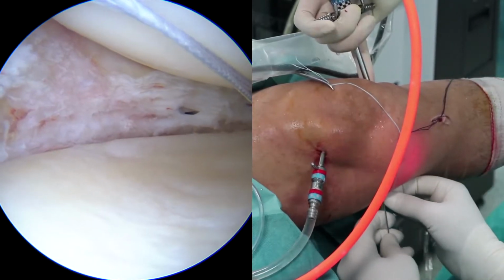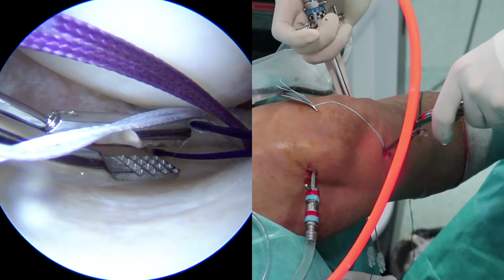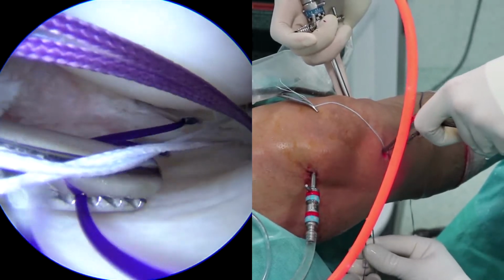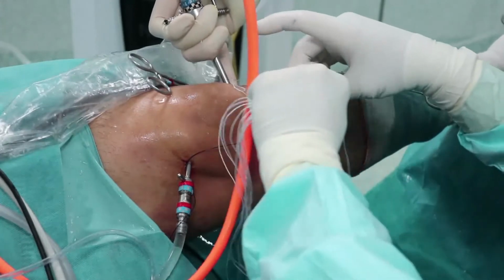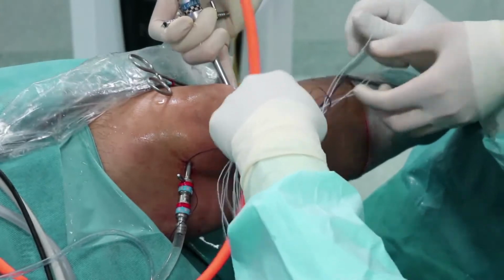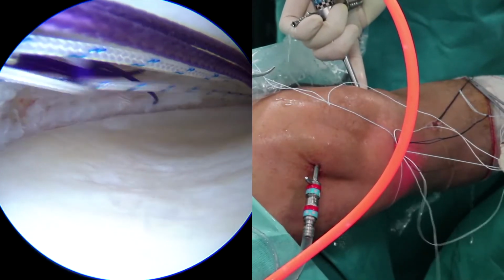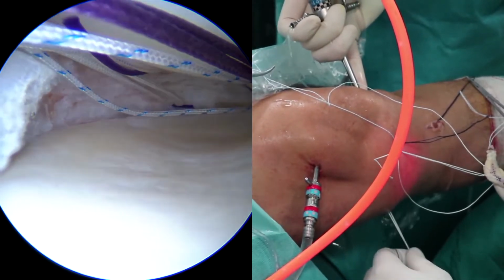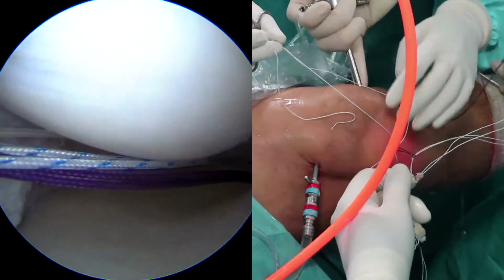Next, a suture passage device is used to place a transport suture in the posterior wall remnant. Before graft placement, 2 number 18 spinal needles are introduced in the posteromedial knee angle in an outside-in manner through the skin and the knee capsule. 2 number 1 PDS sutures are introduced through the upper and lower meniscal wall and recovered through the anteromedial portal. Definitive sutures preloaded in the bone plug and the posteromedial angle are then passed, and the meniscus is carefully introduced manually inside the knee with gentle pulling from both threads.